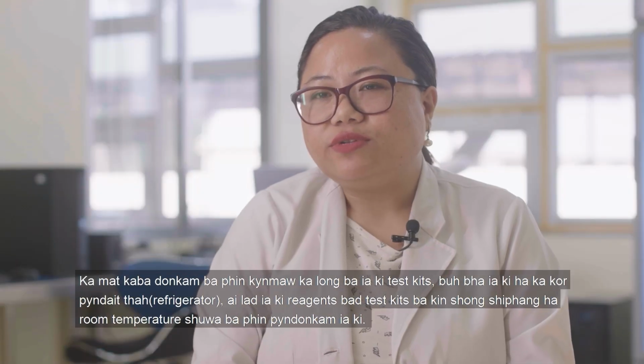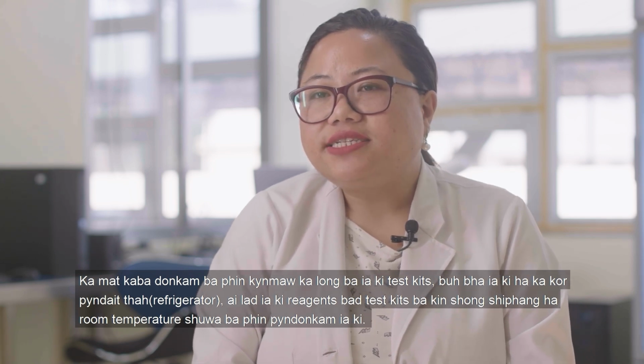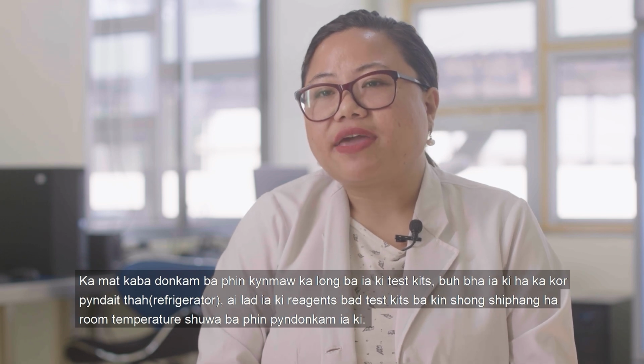An important point to be noted, for test kits that are stored in the refrigerator, the reagents and test kits should be allowed to come to room temperature first before performing any kind of test.